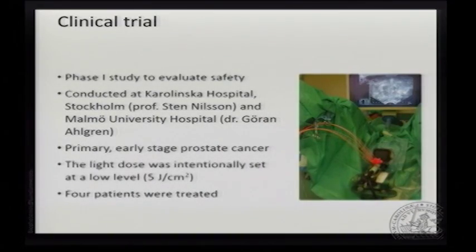We have done a very first clinical trial with 4 patients. That was done in Sweden, in Stockholm and in Malmö. And it was primary early stage tumors. And we delivered intentionally very low dose, just to see that it was safe to deliver the light with this technique, not really aiming at curing these patients.